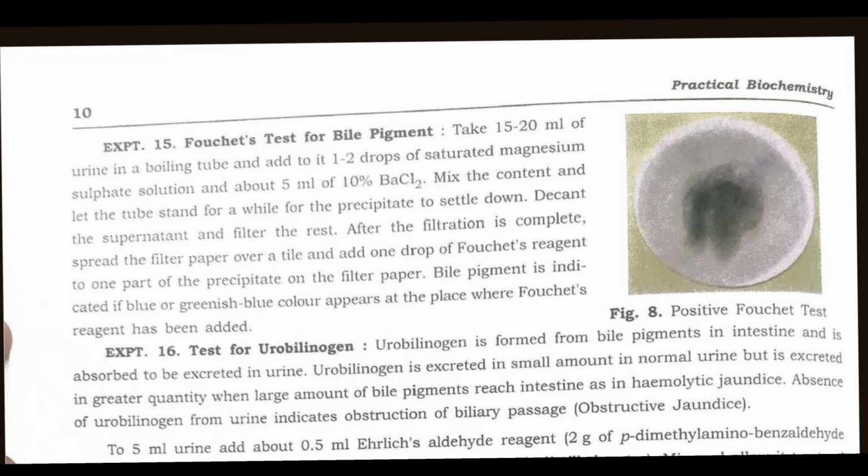अभी सल्फर पार्टिकल डूब गया, सिंक, इसका मतलब उसमें बाइल साल्ट है, नहीं डूबा तो बाइल साल्ट्स नहीं है. एक्सपेरिमेंट नंबर 15, Fouchet's test for bile pigments.